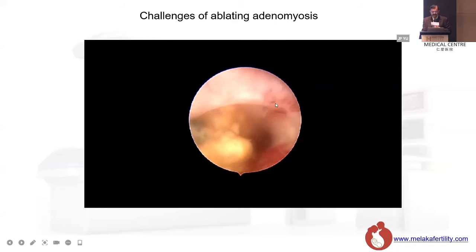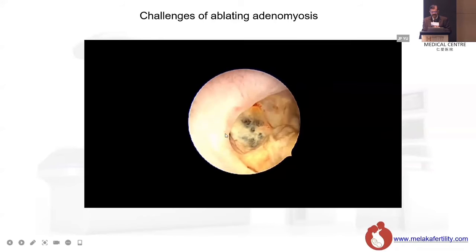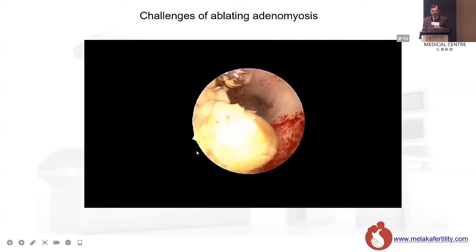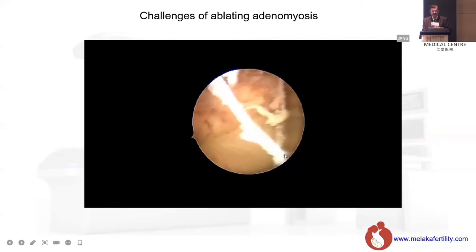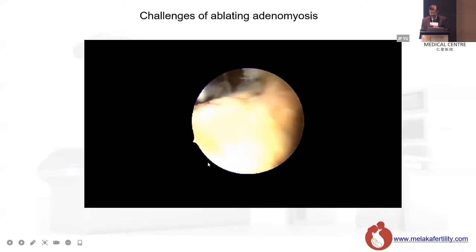And this is how the hysteroscopy looks. You can see that there is a normal area on this side and an ablated area on this side. You can see the necrotic tissue here. And I'm hoping that this necrotic area will fall off. We can take it off, and this will also grow back, and she will be able to conceive.